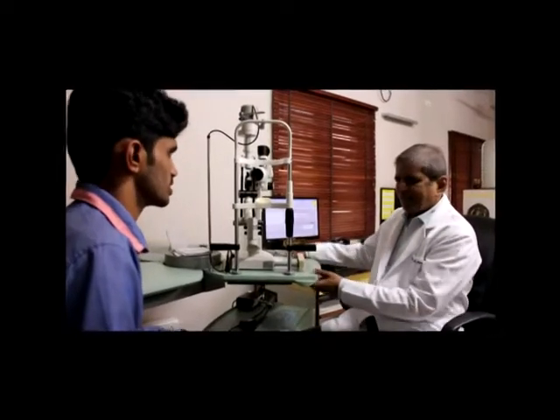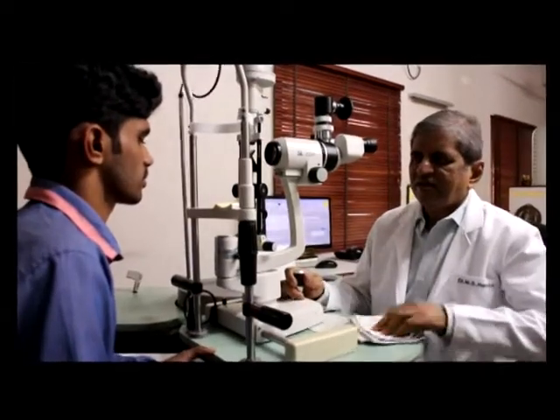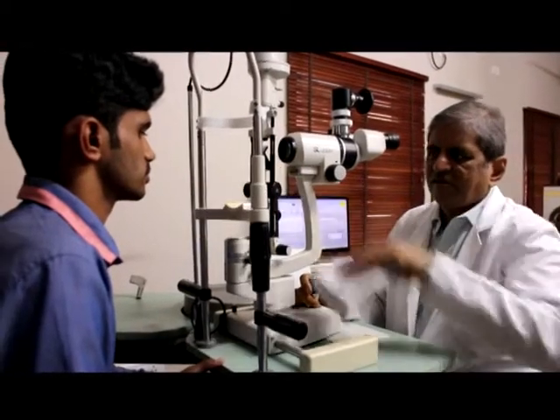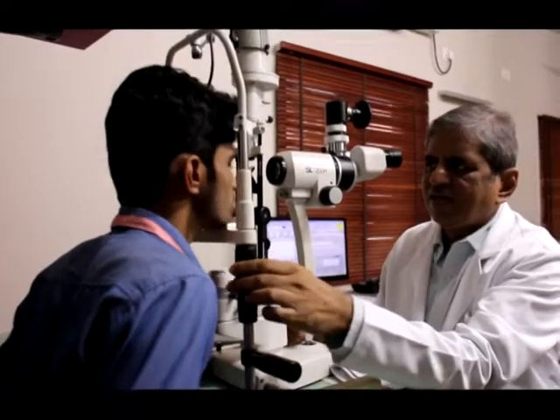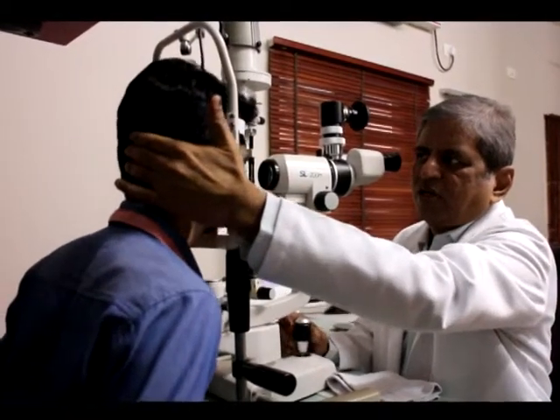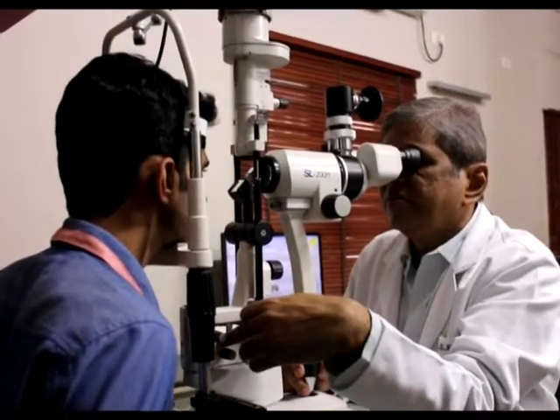The patient is seated comfortably, preferably in a motorized chair. Make sure the chin and the forehead are placed on respective rests. Align the black line on the sidebar to the lateral canthus of the patient and switch on the illumination.